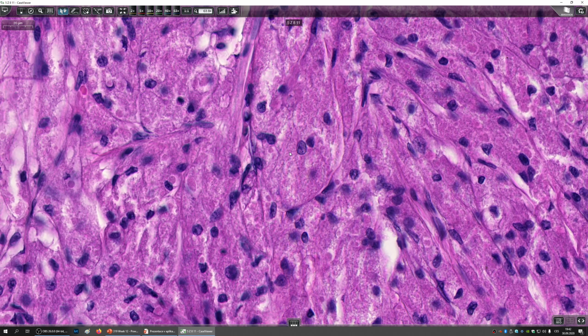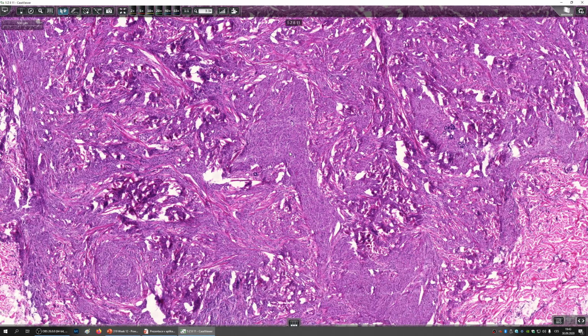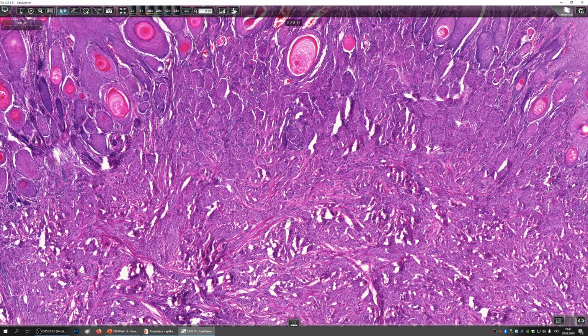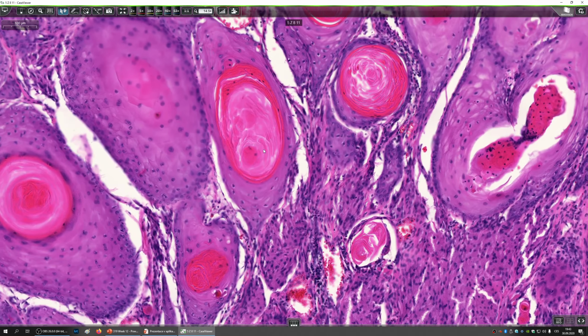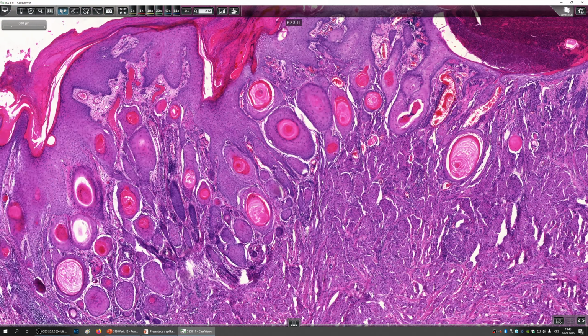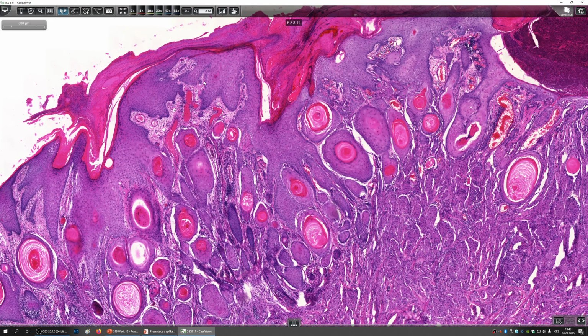But this tumor is totally different. It doesn't secrete anything. It doesn't cause any paraneoplastic syndromes like pheochromocytoma. But it can cause a very interesting phenomenon, which can be quite troublesome in the esophagus. So if we go up and up, we see that here the epidermis is very strange. You see here this keratinization. So the epidermis has enlarged a lot. Look, this is how thick the normal epidermis is. And this is how thick the epidermis is above the granular cell tumor.